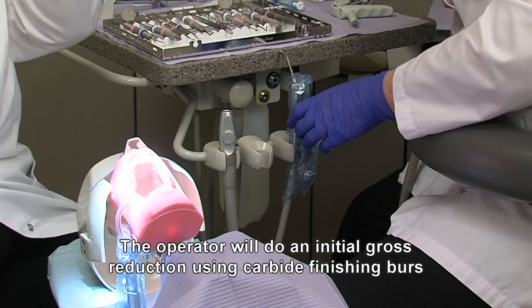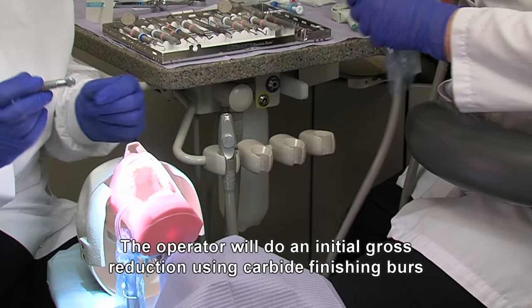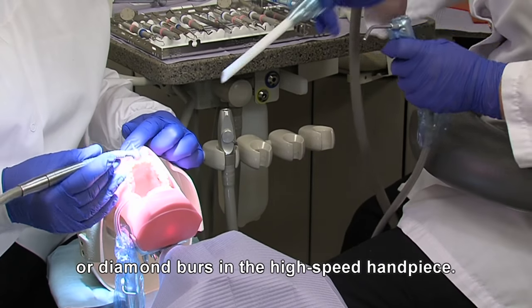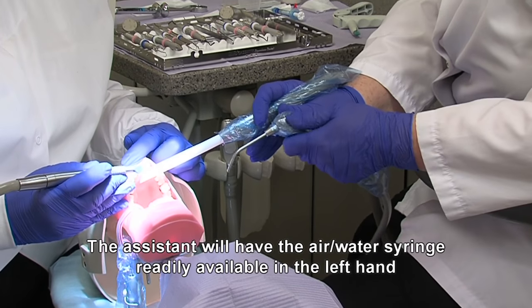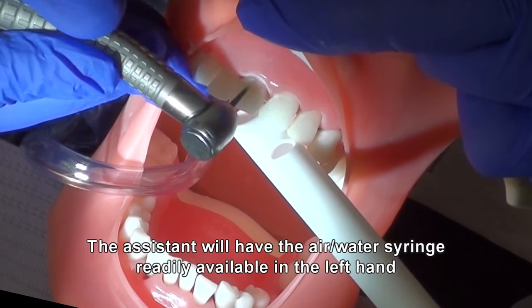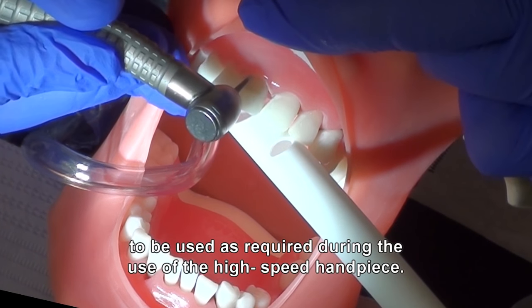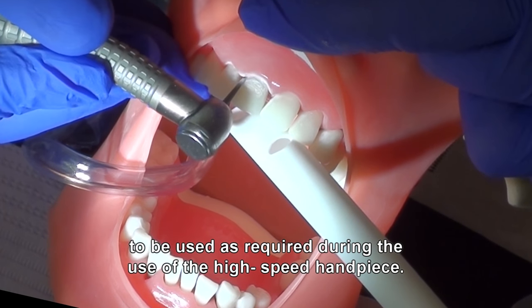The operator will do an initial gross reduction using carbide finishing burrs or diamond burrs in the high-speed handpiece. The assistant will have the air-water syringe readily available in her left hand and the high-volume suction in the right hand to be used as required during the use of the high-speed handpiece.